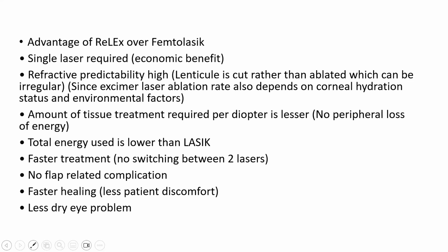The amount of tissue treatment required per diopter is lesser in SMILE. The total energy used is lower than LASIK, and it is a faster treatment because we don't have to switch between two lasers. There are no flap related complications. There is definitely faster healing, less patient discomfort, and less dry eye.